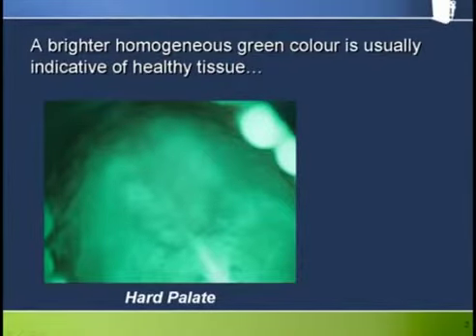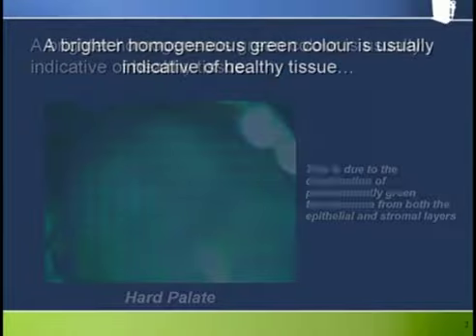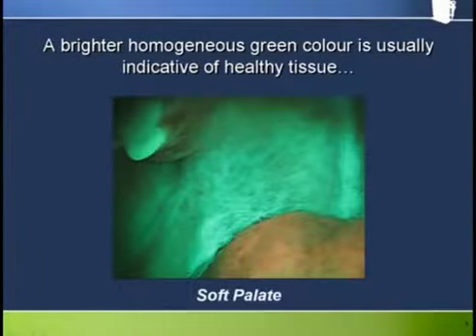Here we see the hard palate, which shows, generally speaking, as a broad expanse of green. The soft palate is also generally green. The darker areas around the borders of this image are from shadowing due to the way the blue light has been directed at the tissue.